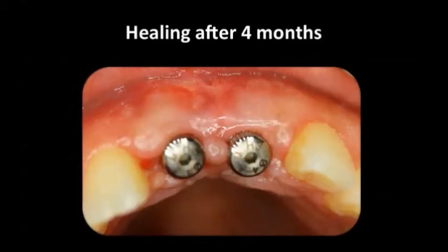This is the healing after 4 months. The patient had been wearing the suck down tray. We didn't have to bond and rebond and all the things that usually some people do. You see that you bond and then the bonding comes off; the patient removes this one, cleans it nicely, and makes sure the implant is clean. She can always brush her teeth properly, and there is no plaque or bacteria accumulated.